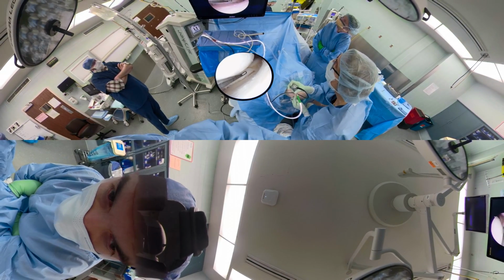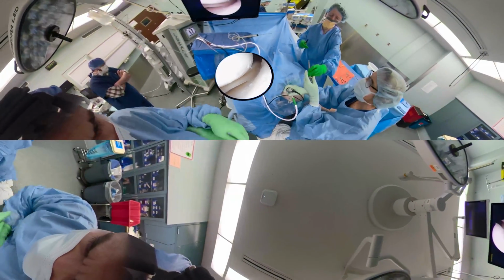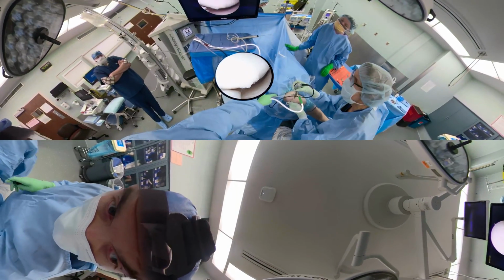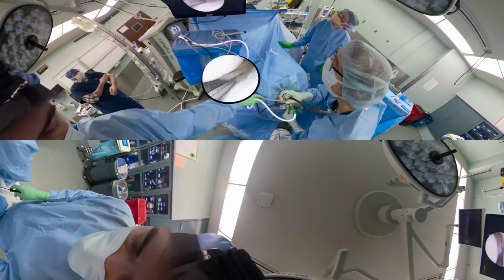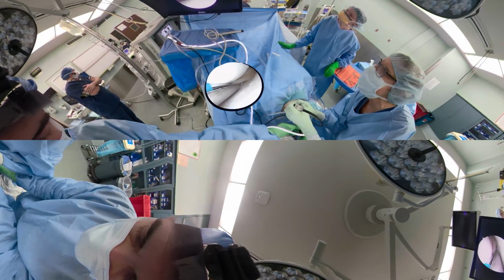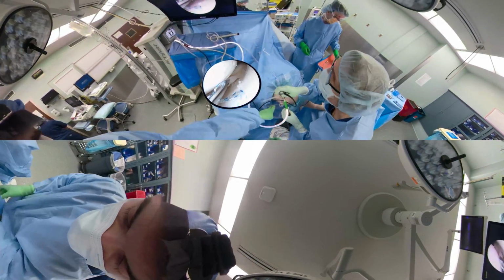Sometimes it'll be a little hard to tell that if you're not opening the joint up enough and changing your flexion extension. Usually you're in a little more extended position. So now to do the repair, we've done a trephination with a small rasp, and now we put this jig into the back of the knee, so then we can get the Fast Fix in without dislodging the pledget. There's a little bit of a curve to this.